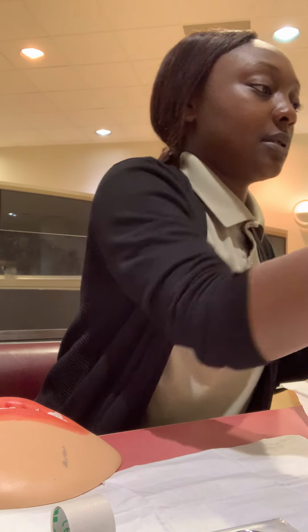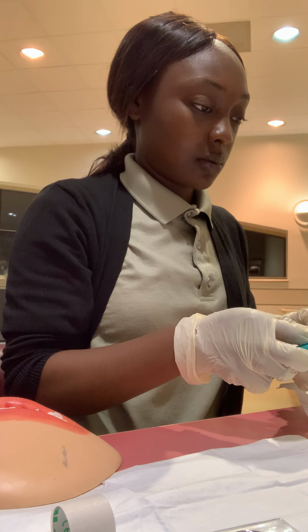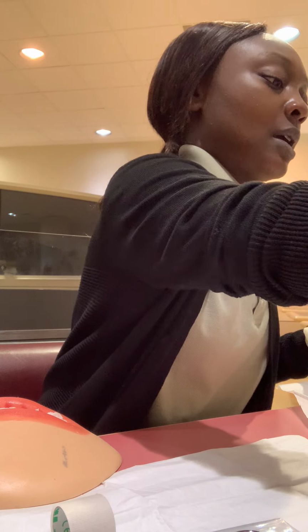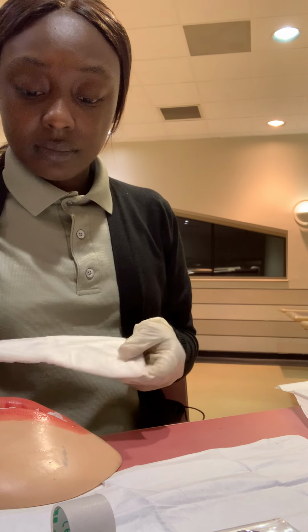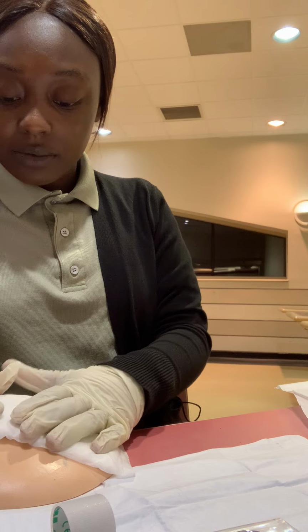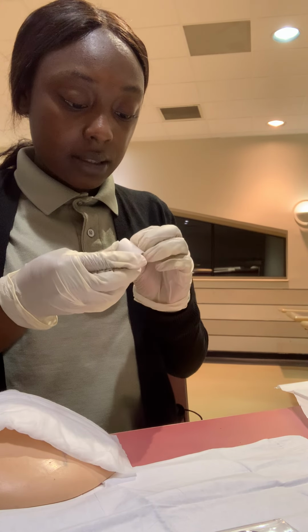I am going to take my pad with the blue side up. Take that on the patient's skin. Get my tape.